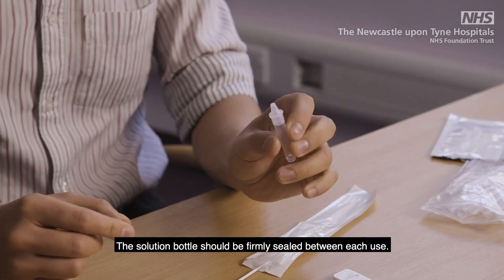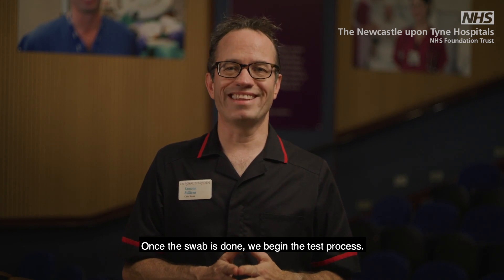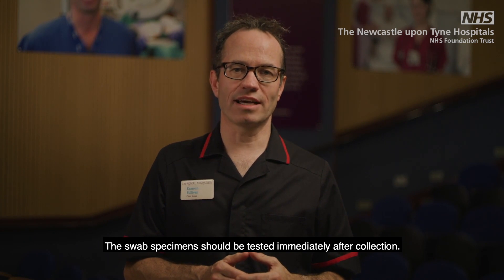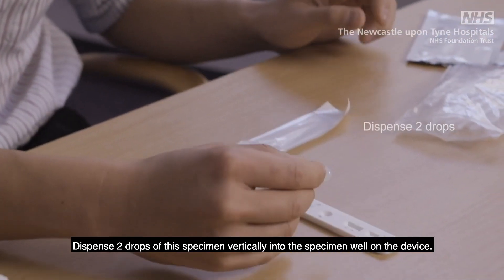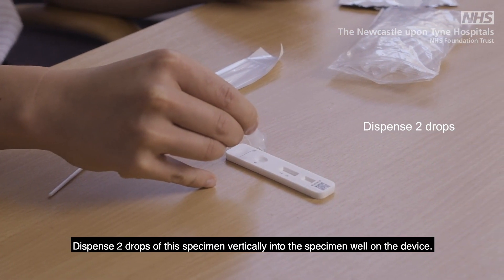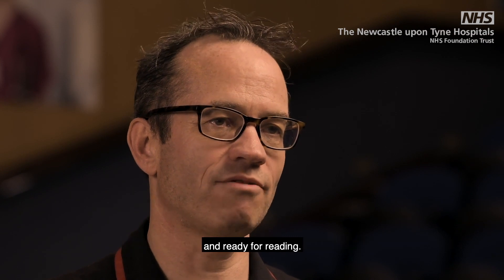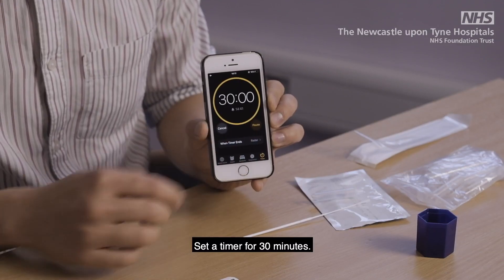Now place the cap on the extraction tube. The solution bottle should be firmly sealed between each use. Once the swab is done, we begin the test process. The swab specimen should be tested immediately after collection. Dispense drops of this specimen vertically into the specimen well on the device. Do not handle or move the test device until the test is complete and ready for reading. Set a timer for 30 minutes.